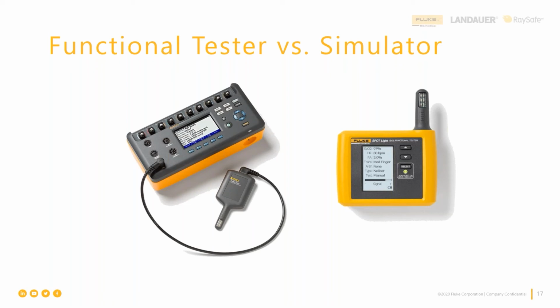We're producing something that is mimicking the light, the electrical and optical equivalent of what happens in the blood. So it is not a true simulation. It is rather instead a functional test of the oximeter. Okay, so the proper answer for the previous poll question is no, it is not a true simulation.